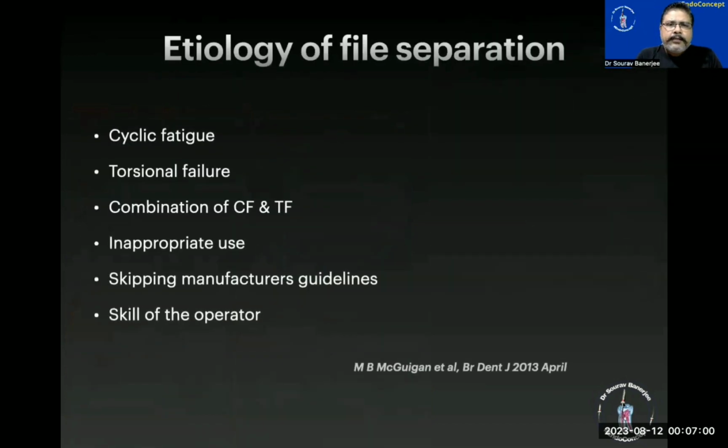So the most important thing that we have to think is, first, it is best to avoid file separation. We have all already studied the popular reasons why your file fails: cyclic fatigue, torsional failure, a combination of both, skill, and inappropriate use. So how can you avoid that?